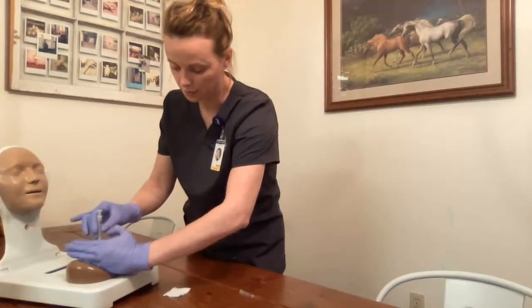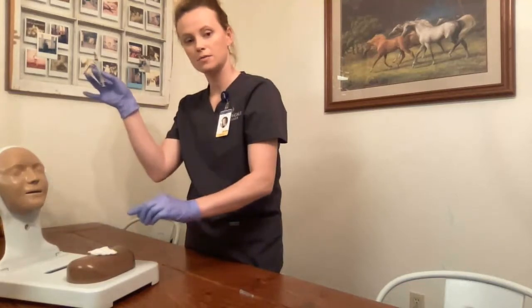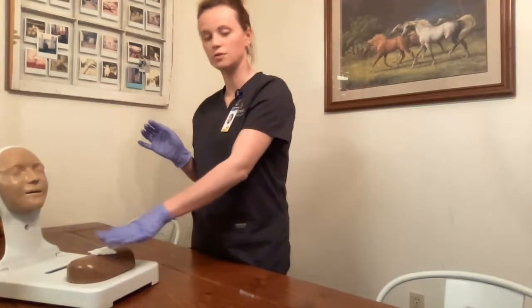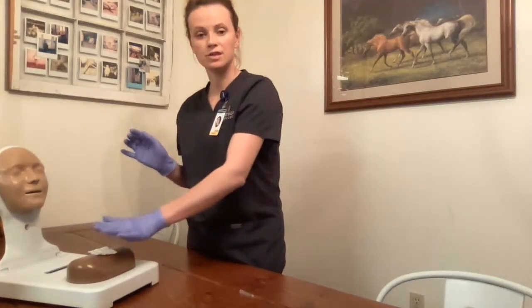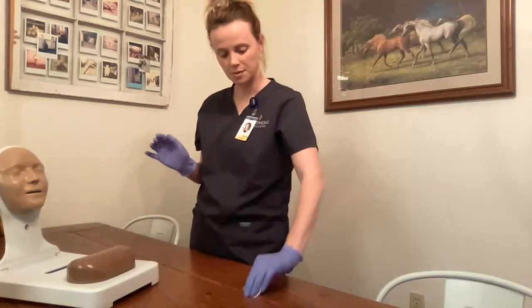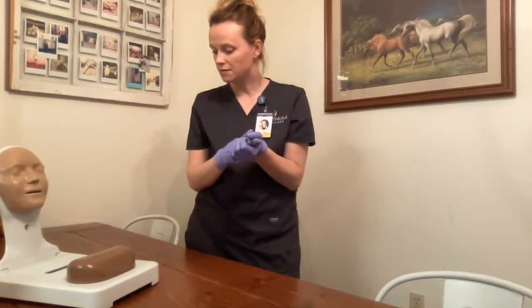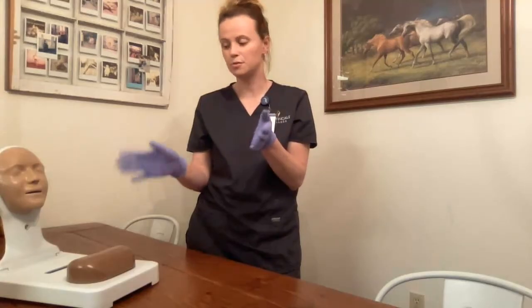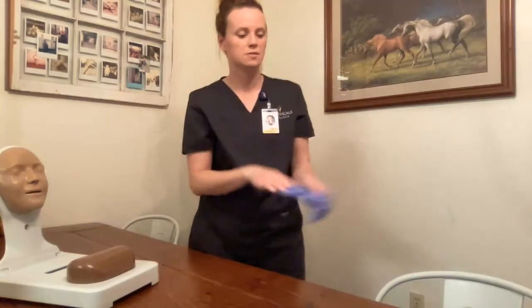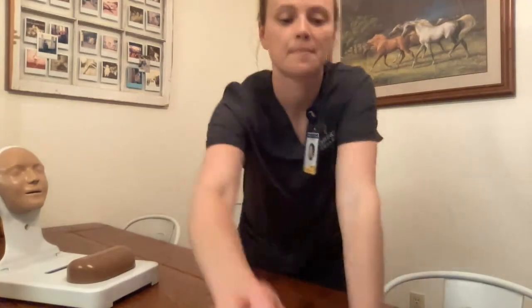I remove the needle, release the skin, and place the gauze pad on top. I dispose of the needle immediately in the sharps container. I do not rub or massage the site — I just check for any bleeding. There is none, so I dispose of remaining items. Mrs. Smith, are you comfortable? My patient has stated she is comfortable. She has her call light and her bed is in an appropriate position. I remove my gloves, dispose of them in the trash, perform hand hygiene, and go document my results. Thank you.